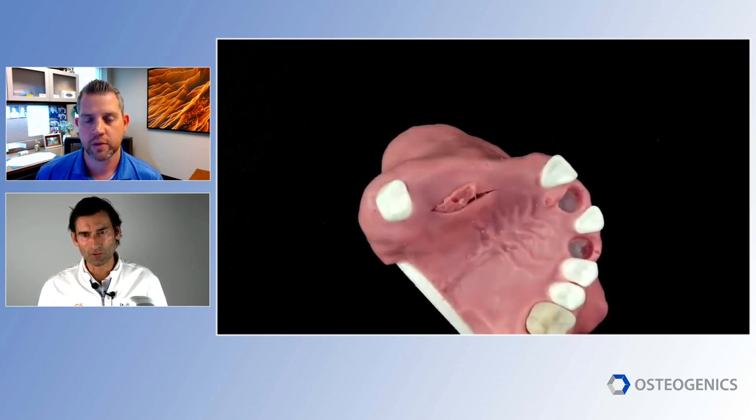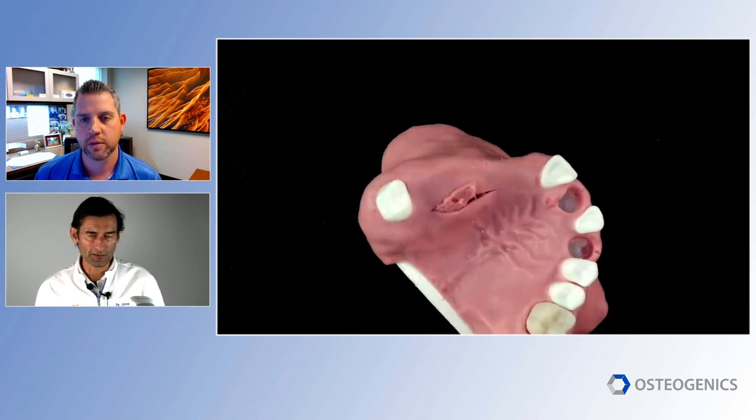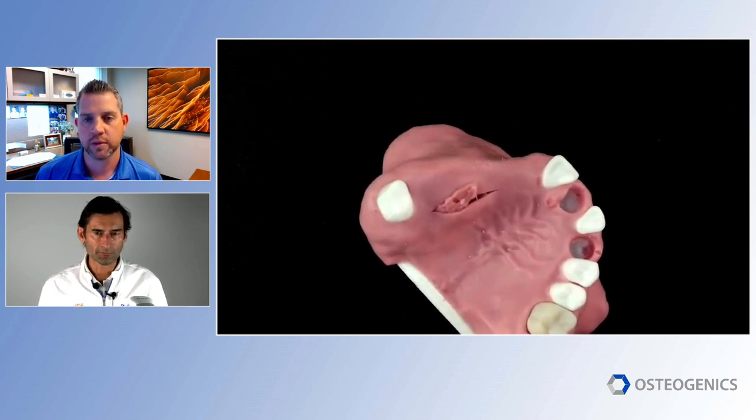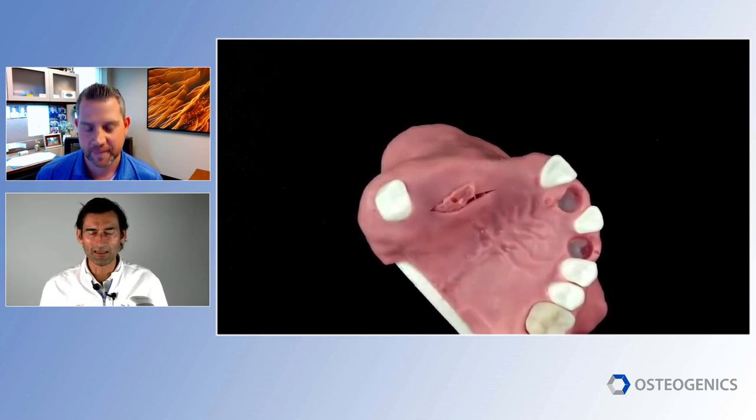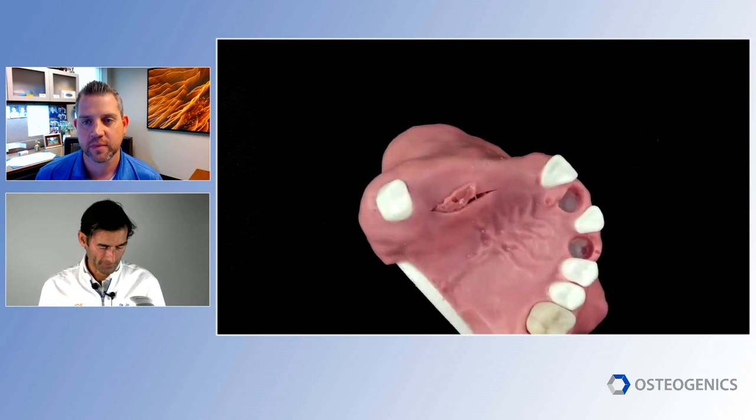So I like that sutures are stable for about 14 days. So I don't need it shorter. If you want it shorter, then just cut it. It's not a problem, because the beauty of resorbable sutures is that if you cut the knot and you leave the suture in place, it will just resorb by itself. So I don't see this as a problem.